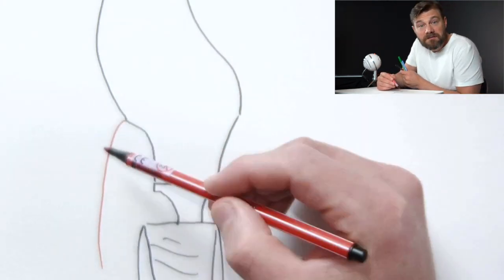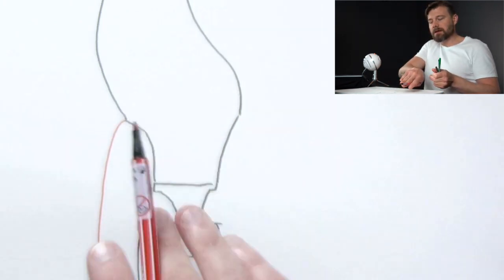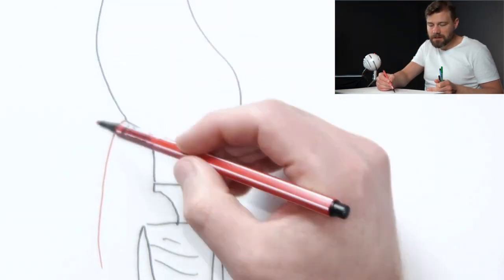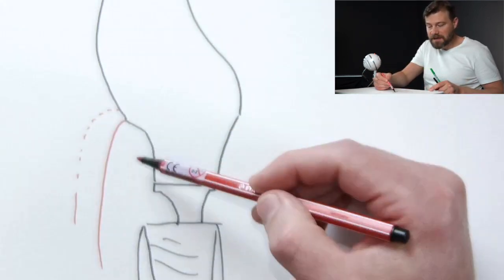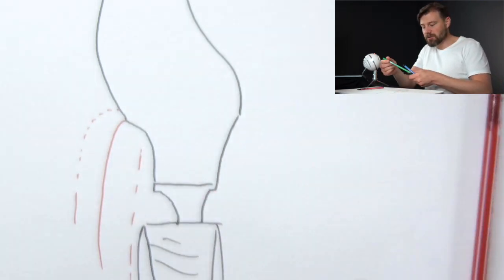As I have a deficiency of the soft tissue volume, the buccal surface is under the surface of the crown, okay? It is not on this area here. What happens if you try to prepare this area here to receive a connective tissue graft?